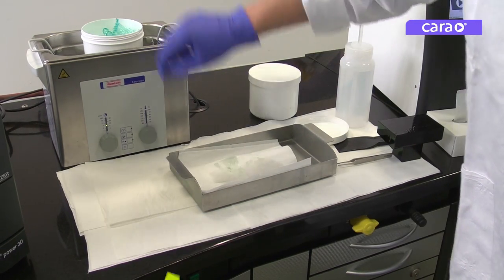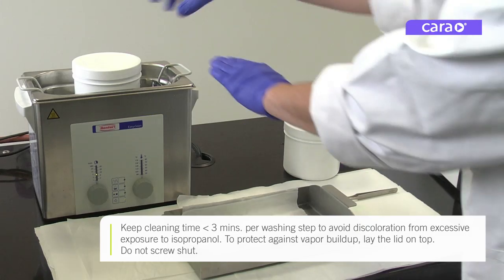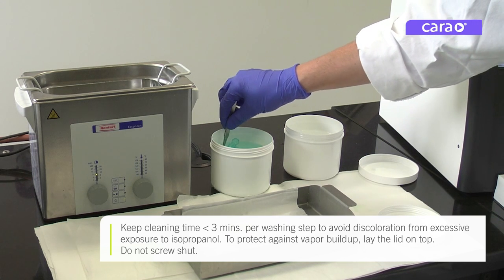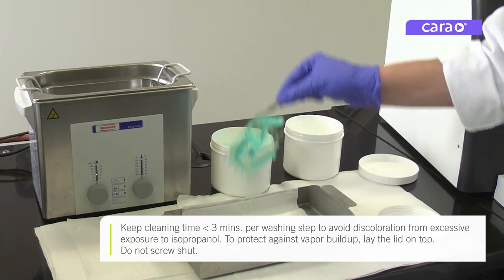Try to complete the entire cleaning process in less than three minutes, as longer exposure to isopropanol can result in surface discoloration. To protect against the buildup of vapors, just lay the lid on top — do not screw it shut.